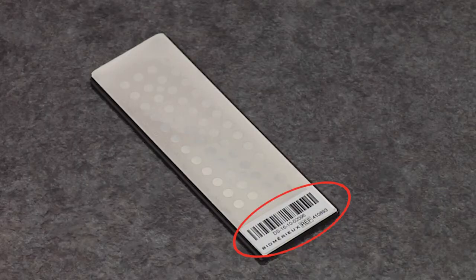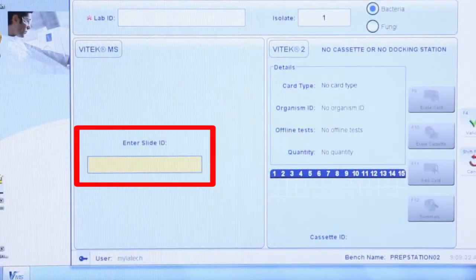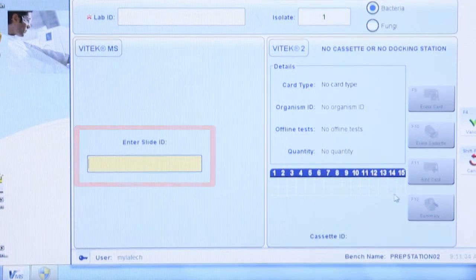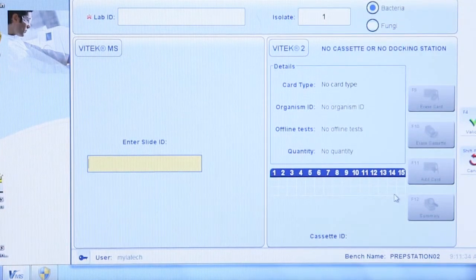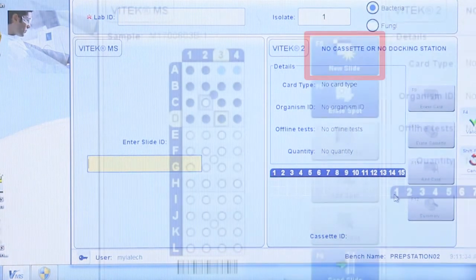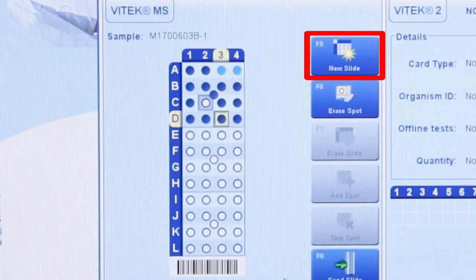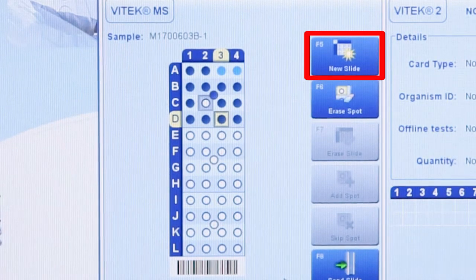Scan or type the target slide barcode in the Enter Slide ID field. Only fields highlighted in yellow are considered active and will allow data entry. Note: if the PrepStation software was used recently, it may be necessary to click the New Slide ID button before the barcode can be entered.